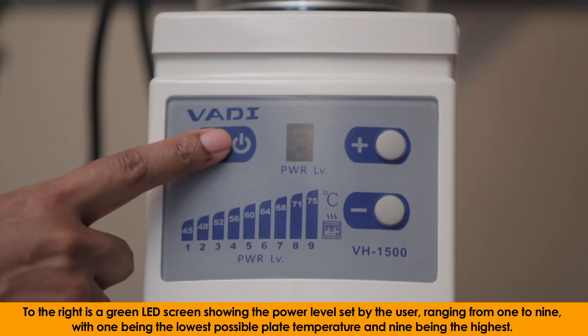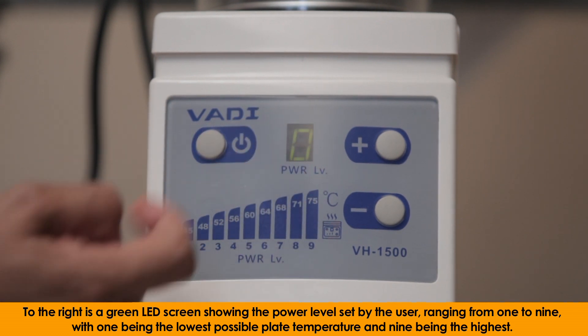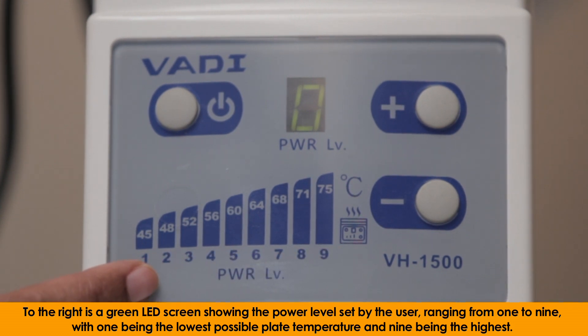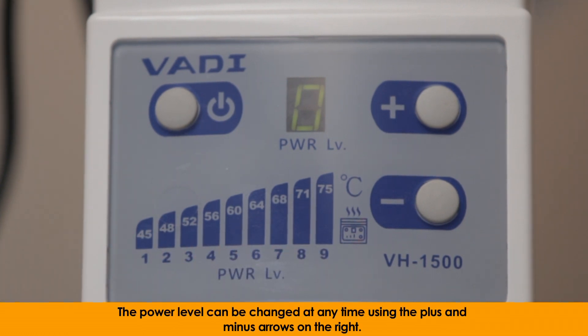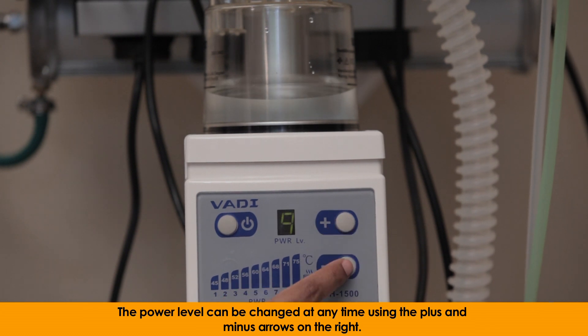To the right is a green LED screen showing the power level set by the user, ranging from 1 to 9, with 1 being the lowest possible plate temperature and 9 being the highest. The power level can be changed at any time using the plus and minus arrows on the right.